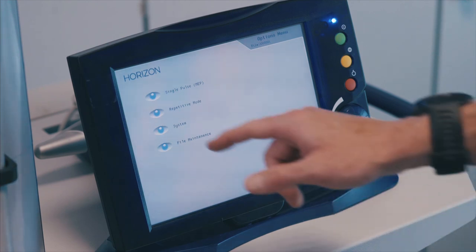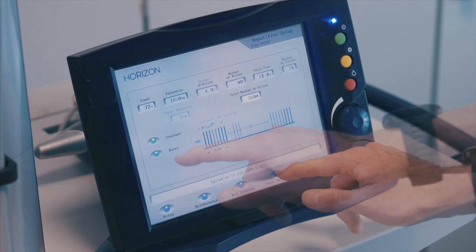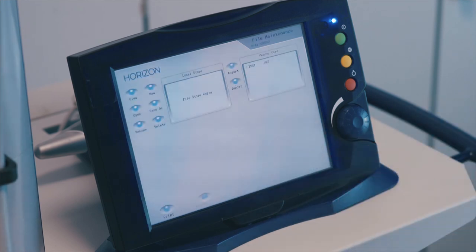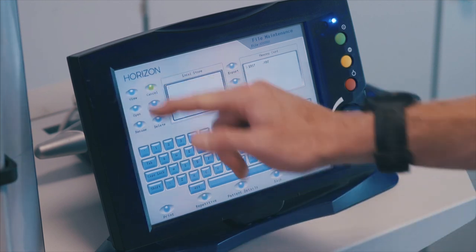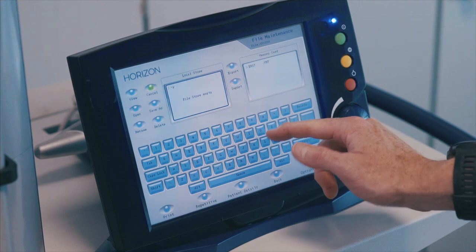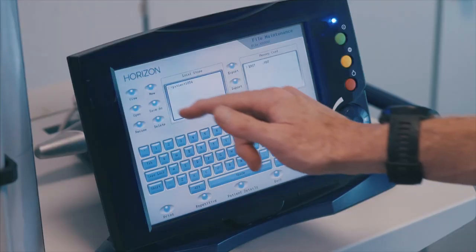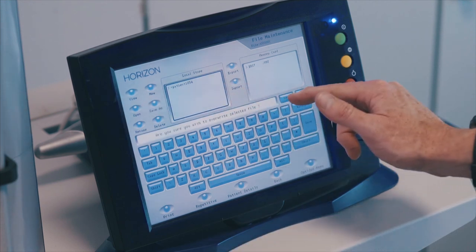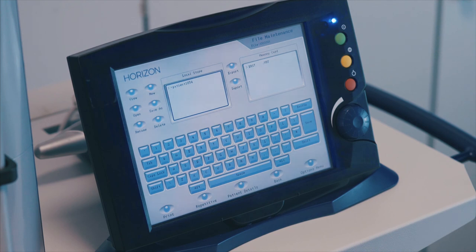To save a customized protocol, from the options menu select repetitive mode. Set the required protocol, then select the save session button. Select new, enter a unique name for your file, and press save on the keyboard to set the file name. Press the save as button and confirm that you wish to overwrite the file. Your file is now saved. To return to treatment, press repetitive.